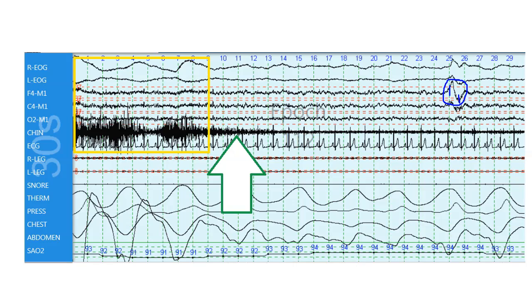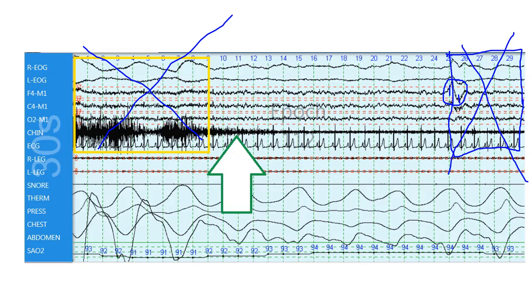So how do we actually come to a conclusion? Well, we can rule out that it is wake because there's only nine seconds of the epic made up of wakefulness. We do not see any spindles, and so really the first view of possible stage two comes at second 25. Only five seconds of the epic are made up of stage N2, so it can't be N2 — we cannot score it as N2. That means the remaining part of the epic, about 14 seconds, is stage N1. So we would actually score this as stage N1.